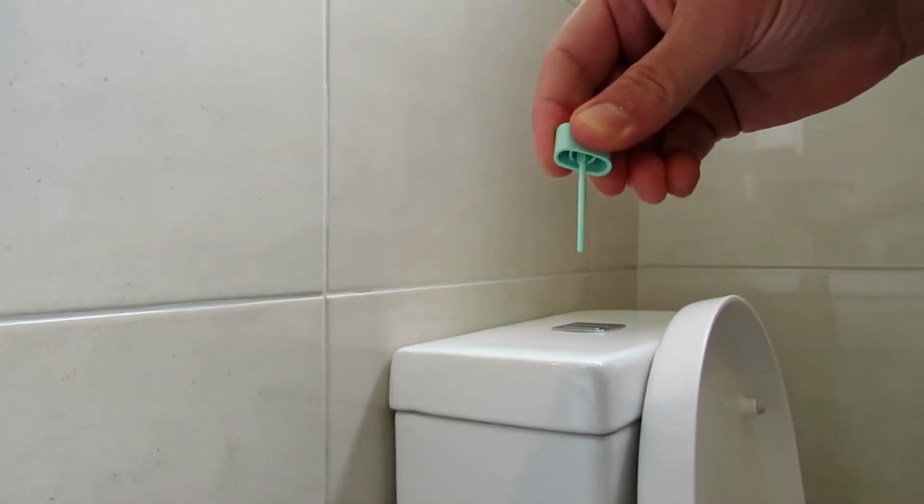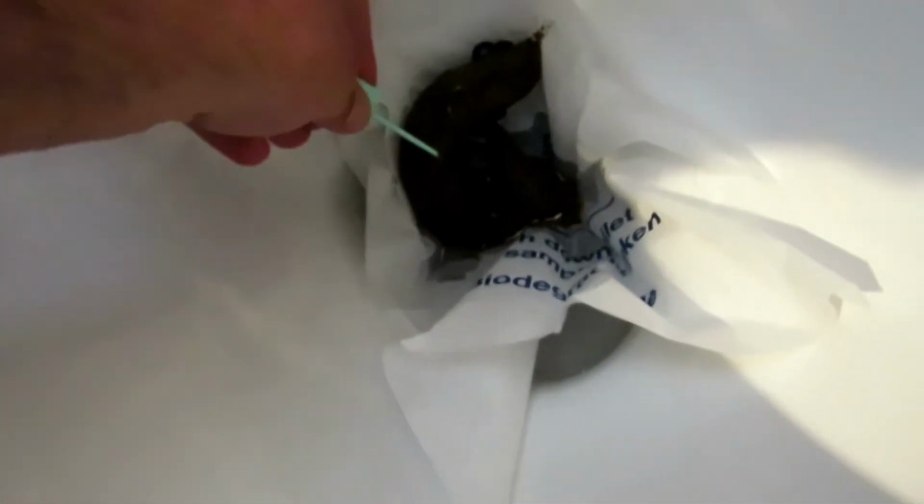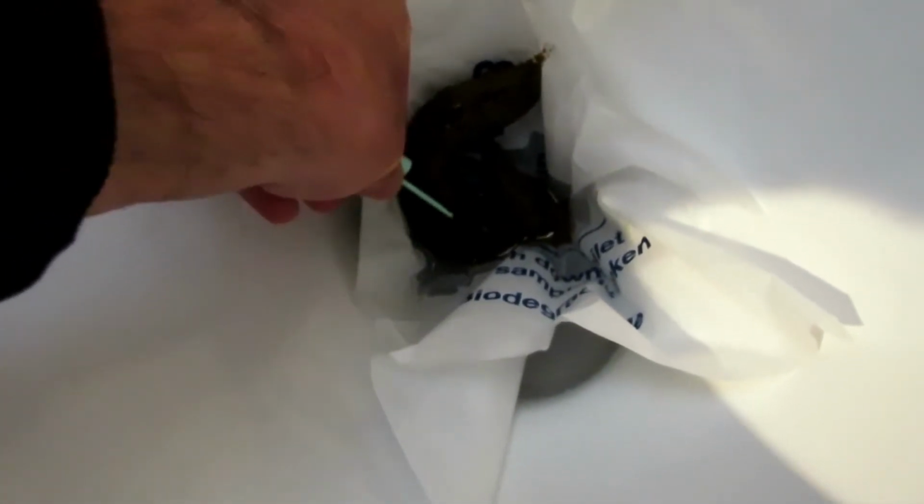Now here we go again. Warning, warning. You just scrape the tip of the collection stick over different areas of the poo so as to collect a tiny sample, about the size of a grain of rice, as it says in the instructions. Long grain or short grain, I hear you ask? No idea. Maybe go medium grain. I might never eat rice again. Now I did it bent over the bowl so I could film it. Oh no, I think I'm the nutter. But you can just stay seated, of course, and do it between your legs.